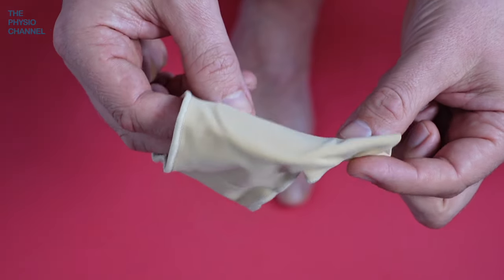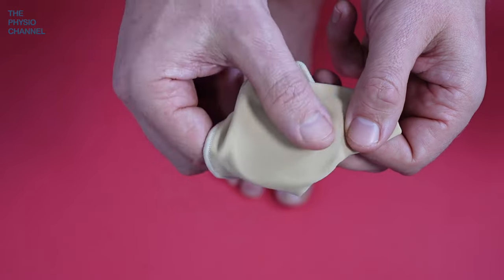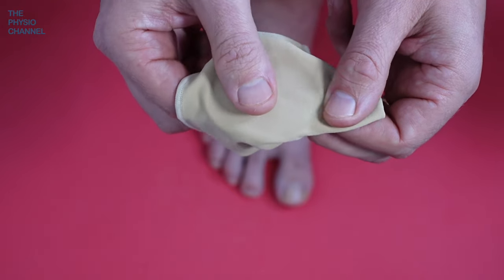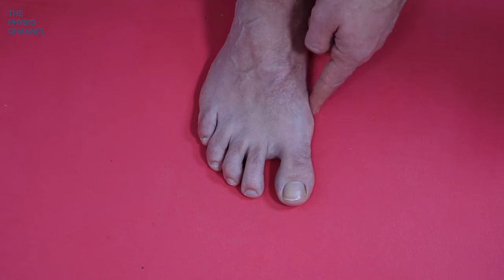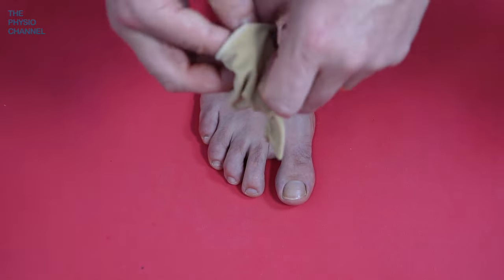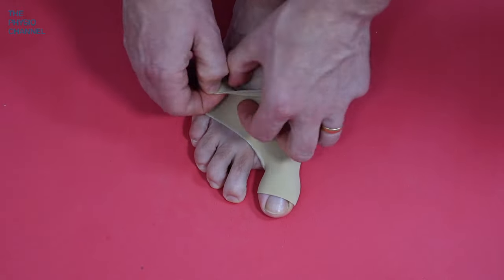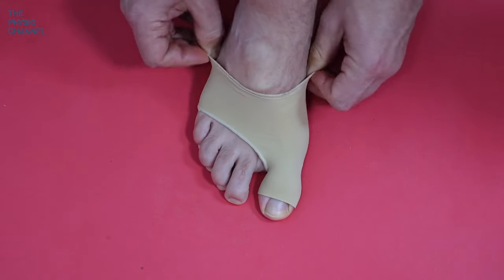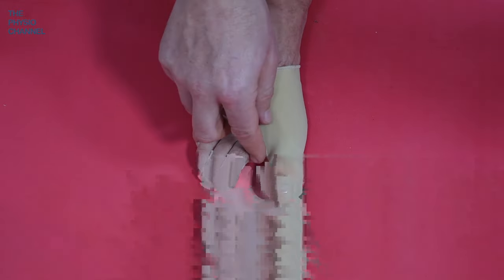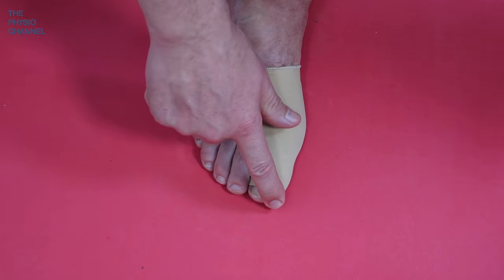Next I want to show you this bunion sleeve. This small piece of material slides over the foot and toe, and it has a pad made of soft gel — just a few millimetres thick — that goes over the side where soreness and a bunion may be developing. It protects that area, stops the skin rubbing, and makes it more comfortable. It's pretty easy to fit, slides on, and comes in different sizes — this is a one-size-fits-all. By its design, it also helps keep the toe in alignment, depending on how far it has drifted across.